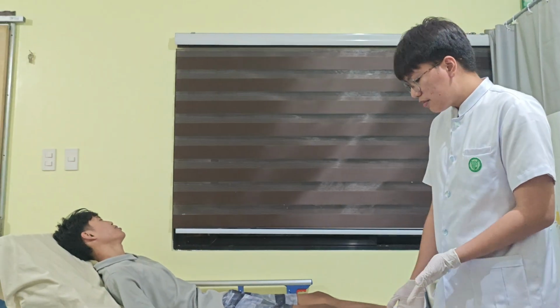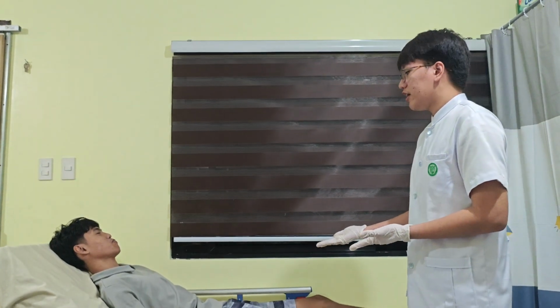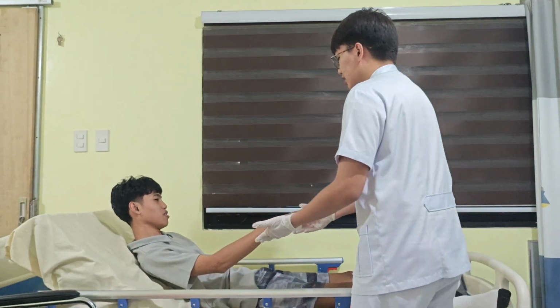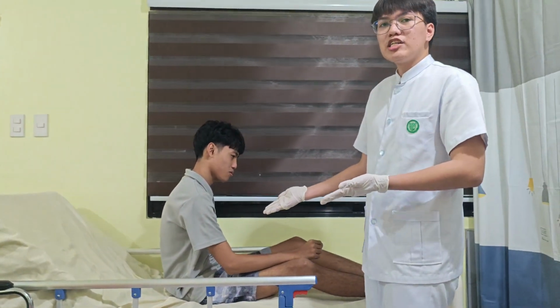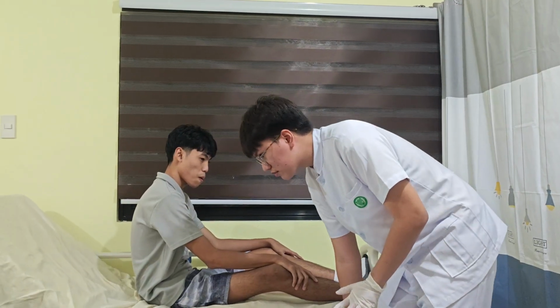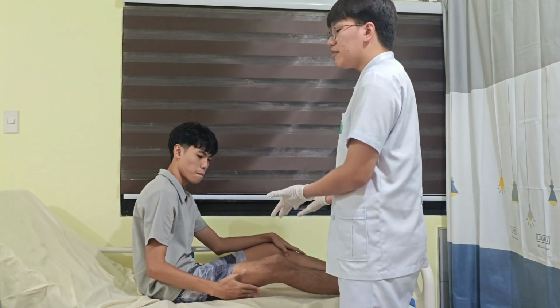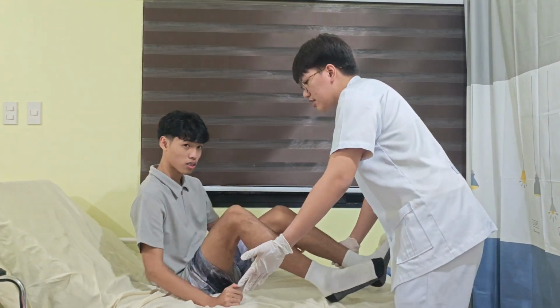After making sure that the bed brakes are locked, I'm going to ask the patient to sit upright. Sir, could you please sit upright? Okay. This facilitates patient independence. After that, I'm going to lower the side rails. After that, I'm going to ask the patient to move their feet onto the ground. Sir, could you please move your feet on the ground, please?